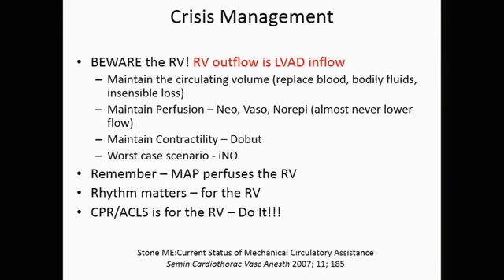The mean arterial pressure perfuses the RV. Rhythm matters for the RV. People who have LVADs in do best in sinus rhythm at a perfusing rate.